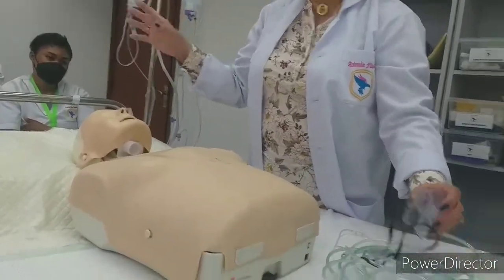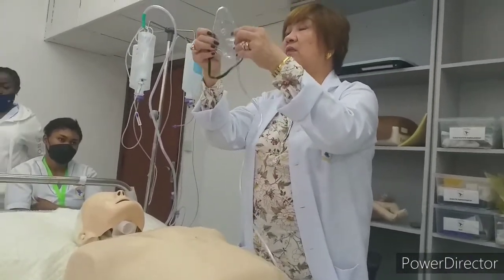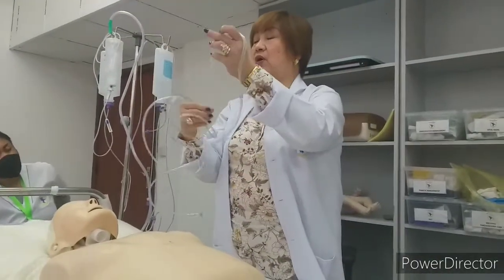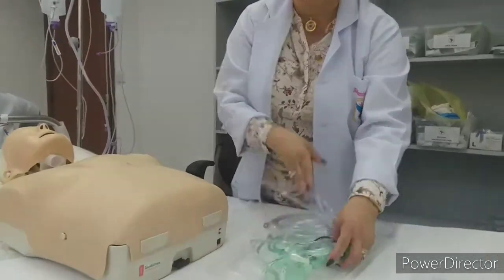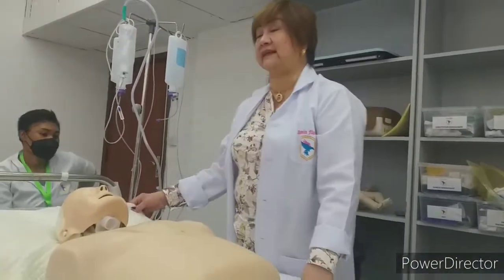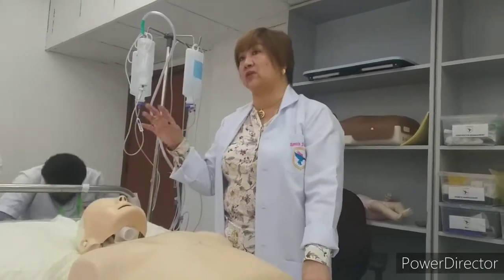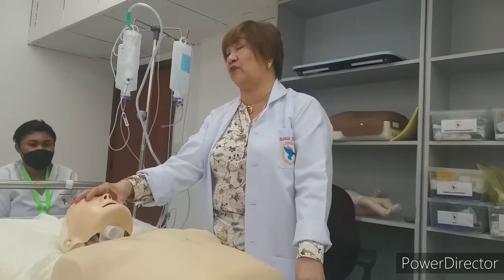Okay, so what we have in our oxygen administration, we have 3. The normal one, or the normal oxygen face mask, and the second one is the oxygen with nebulizer, and the third is the nasal catheter, or the cannula, or the nasal prong. Okay, so what should be the oxygen saturation for our patient? 95 to 100. Okay, so by the time, check for the oxygen saturation of your patient. Only then, when it is around 95 or 100, it is time for you to take off your oxygen.